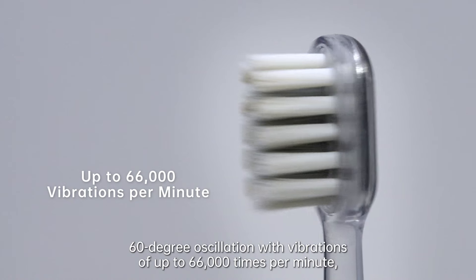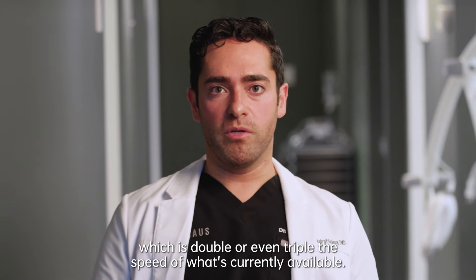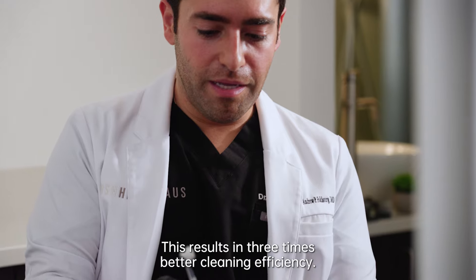The Life End Wave electric toothbrush combines 60-degree oscillation with vibrations of up to 66,000 times per minute, which is double or even triple the speed of what's currently available. This results in three times better cleaning efficiency.